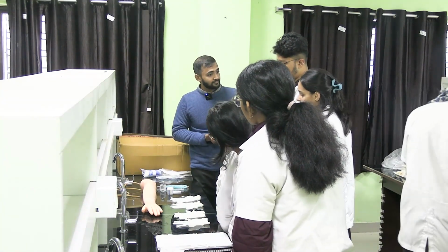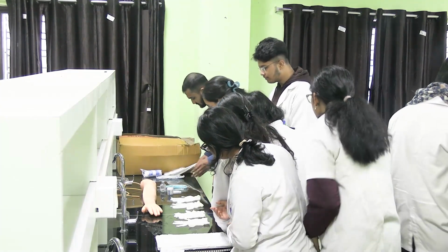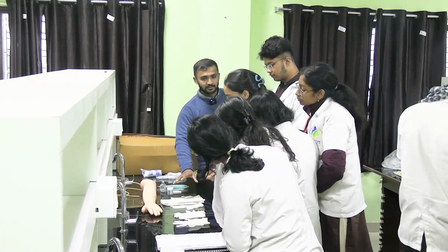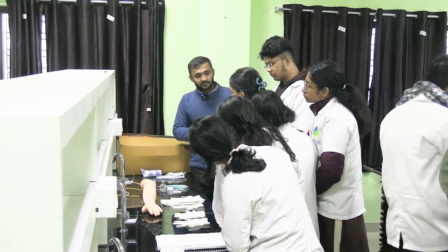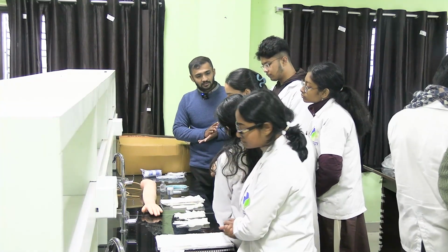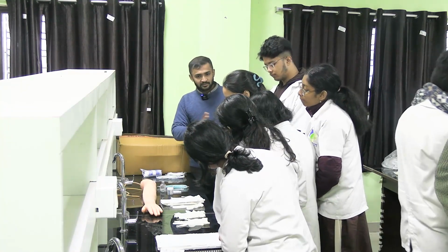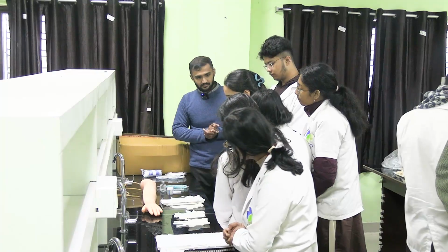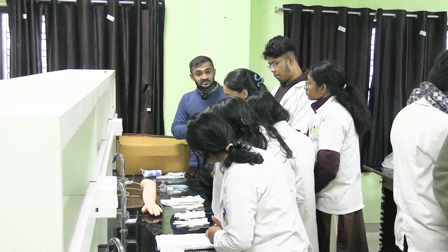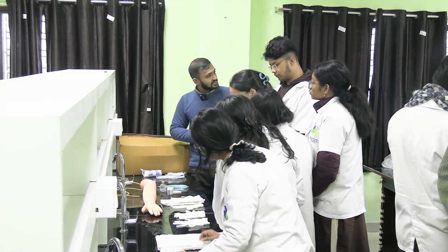Do you know how to wear gloves? Yes, sir. Okay, show me. Suppose this is the gloves. Before touching the gloves, what do you need to ensure? I have to sanitize myself first. You have hand washed, and only after that will you wear the gloves. The first thing is to see whether the gloves are sealed or not. It might be broken, it might be contaminated. So first of all, check that the seal is properly intact.